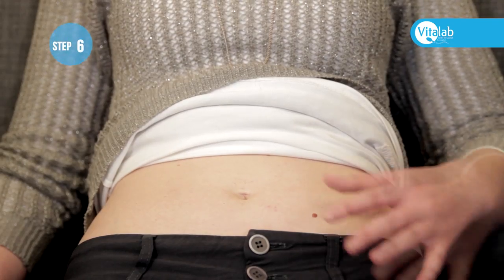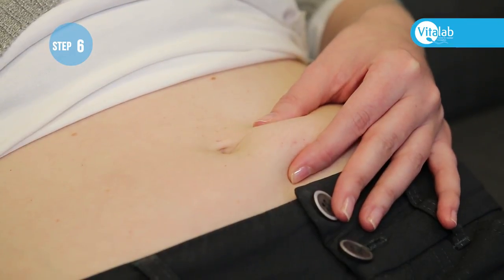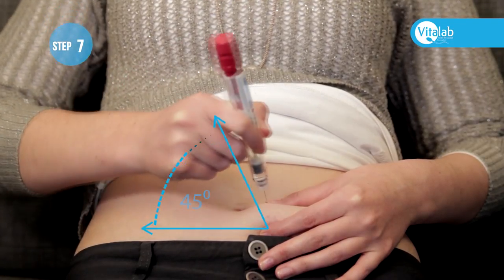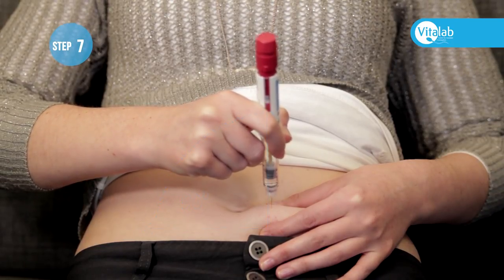Support the flesh between your thumb and finger. Do not squeeze too hard. Push the needle into the abdomen at a 45 to 90 degree angle. The 90 degree angle reduces post-injection bruising.